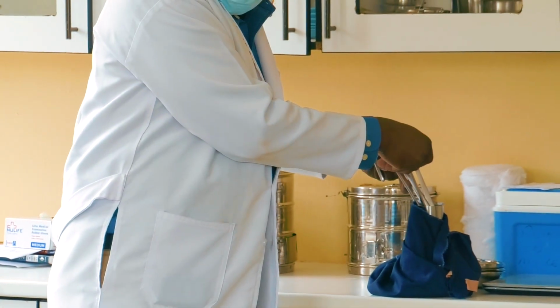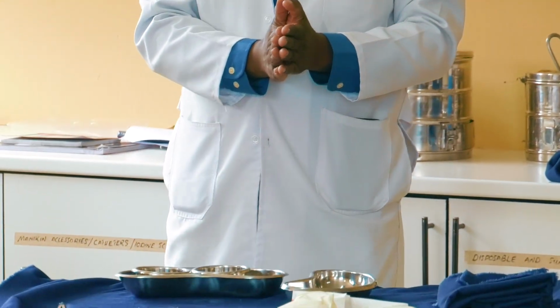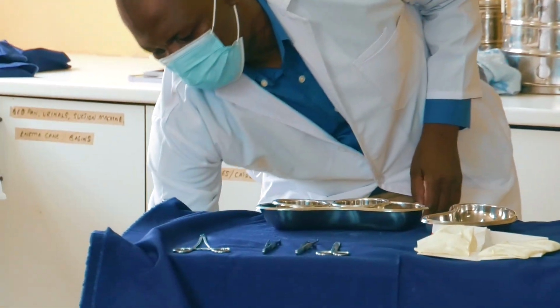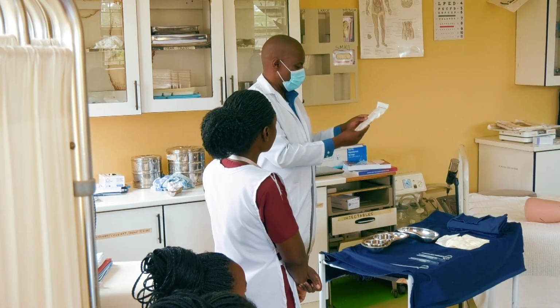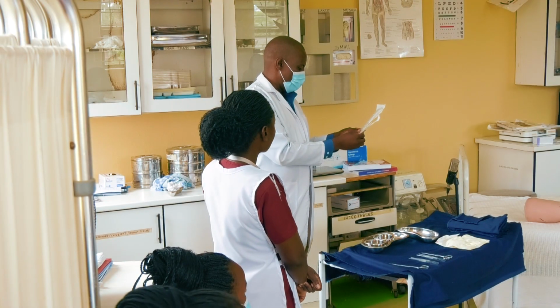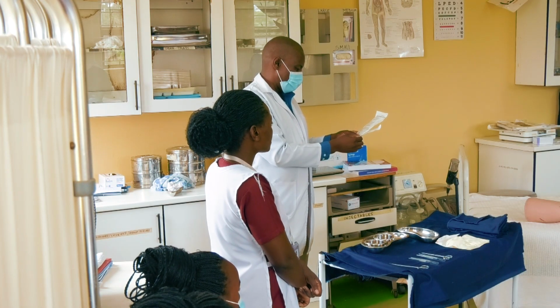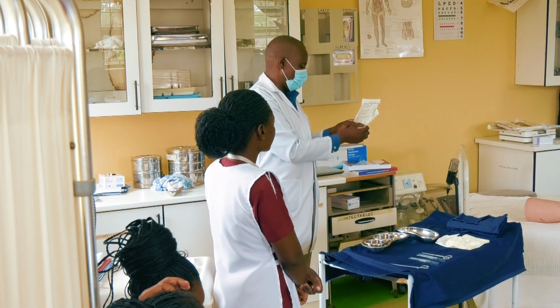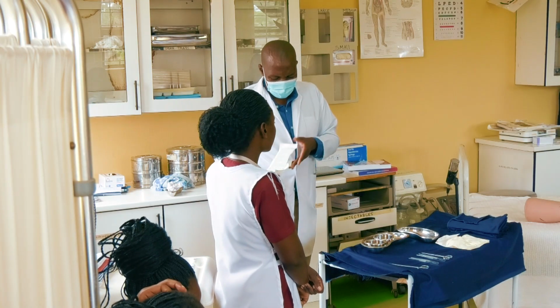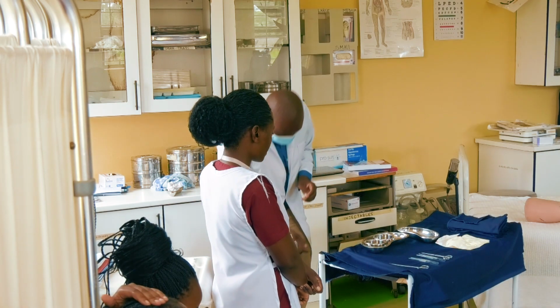The suture, I need to get the suture. Everything you're putting here, if you are being assessed, even the gloves have an expiry date, right? So you have to tell your assessor that these gloves are still sterile, I can use them, okay? So you have to look at the expiry date. When are they expiring? This one is saying 2030, the 4th month, which is April, right? So it's okay.